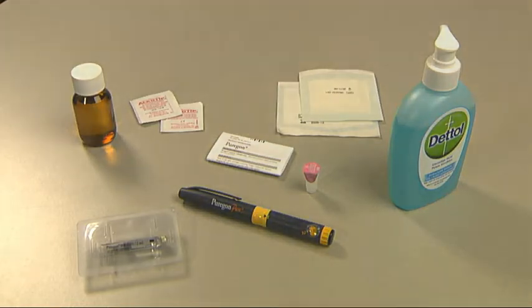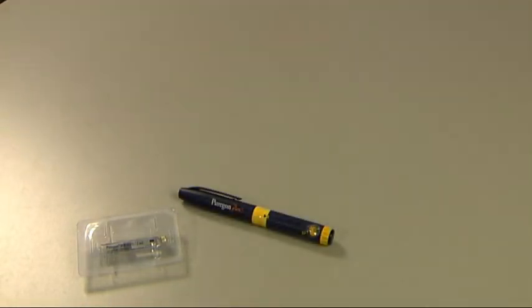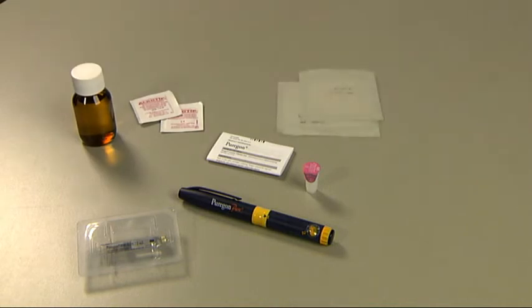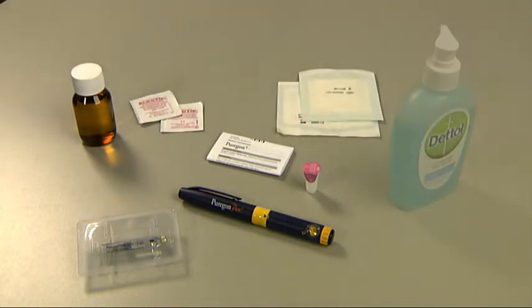For your injection of Puragon, you will need: a Puragon cartridge, your Puragon pen, one of the micro-fine pen needles that comes with your Puragon cartridge, some alcohol swabs or pads, sterile gauze, and antibacterial soap.